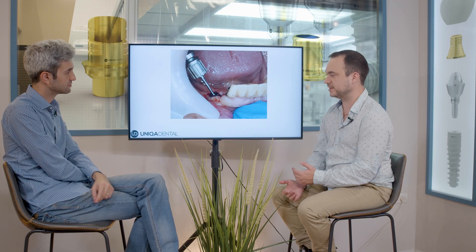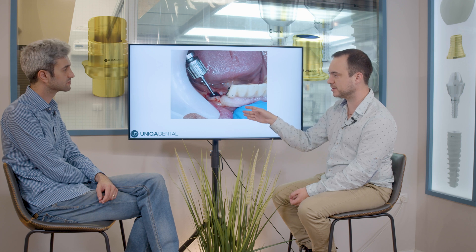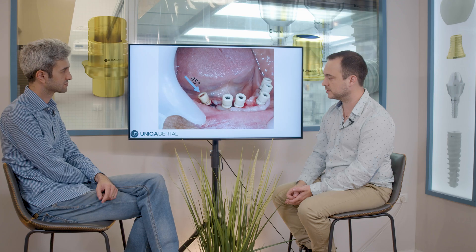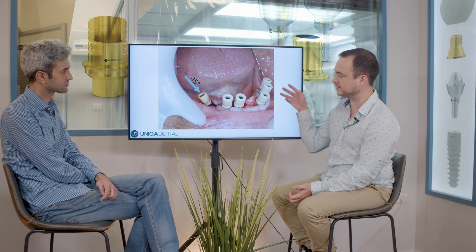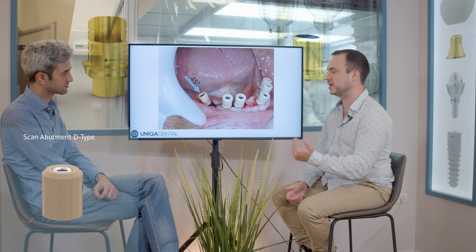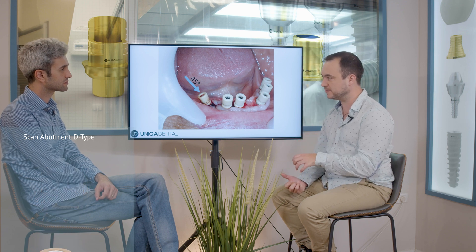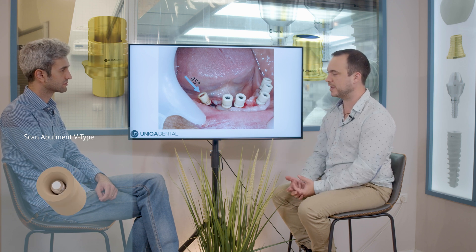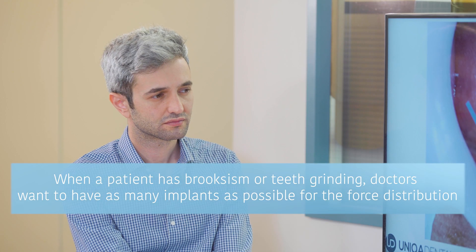We still added one implant where she had some bone left, going above the mental nerve, and we have this angulation. We'll correct this angulation with an angulated multiunit abutment. You can see the angulated implant is about 45 degrees. She has six implants. So even though she's grinding her teeth, she has quite enough rigidity for the bridge. When a patient is grinding their teeth — bruxism or clenching — you want to have as many implants as possible because you want to distribute the forces in the mouth, a little bit on each implant.